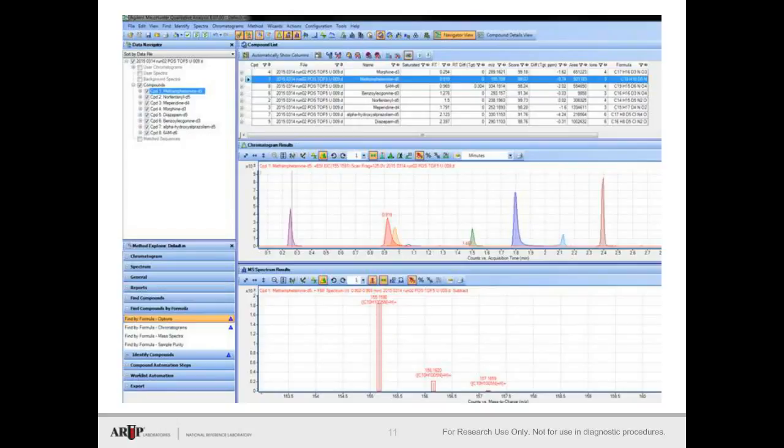In my experience, generally compounds can co-elute as long as they are far enough apart in mass to not interfere with one another's isotopes, which is part of the source identification algorithm, or one isn't going to completely mask another because it's going to be highly concentrated in a biological matrix like urine. Are isobaric pairs fully resolved? There are none in this example, but if there were, they would need to be at least baseline resolved and preferably have a little space in between them.